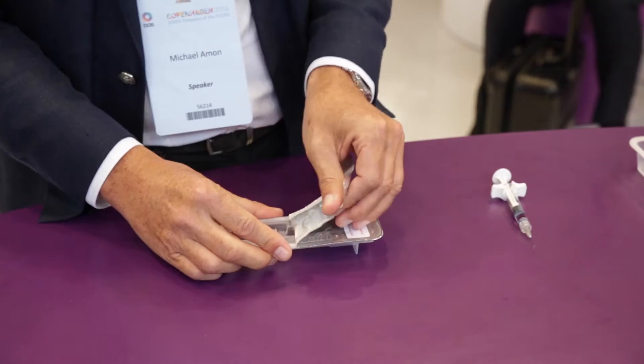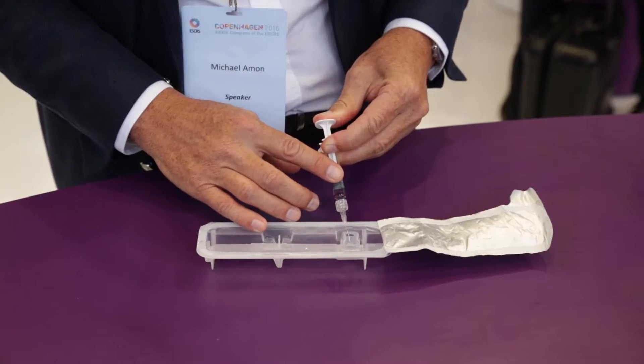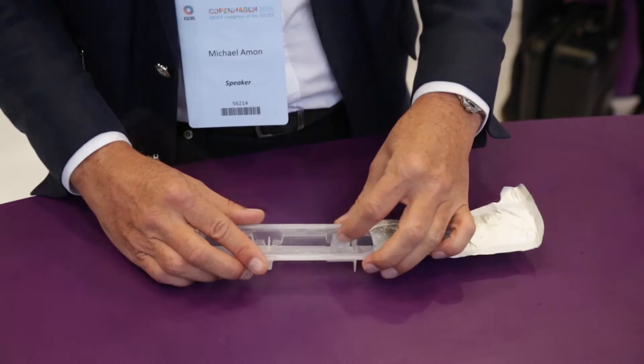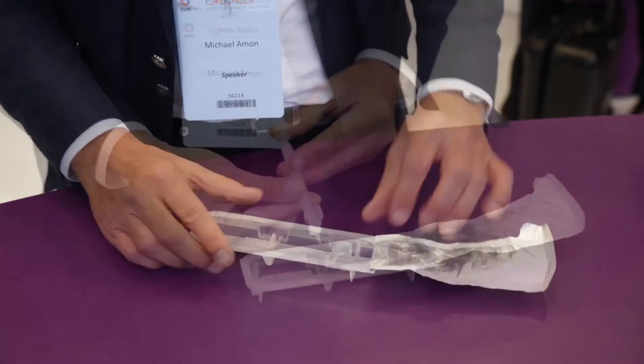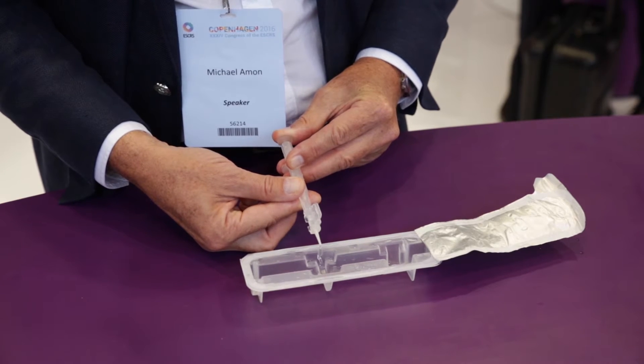I just rolled a Rayner lens with this new Ray-1 pre-loaded system — it was easy to handle. I opened the package, put some viscoelastic into the nozzle, then rolled and implanted the lens through the nozzle, which was very smooth. It only has a height of 1.65mm and the implantation was very smooth and easy.